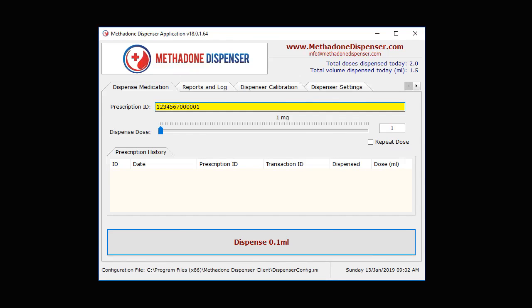All right. So see what happened this time. As soon as we enter the barcode, nothing happened. The whole system is just waiting for interaction before anything happens. At this point, it has captured the barcode and the quantity to dispense, and it does set the quantity to dispense at the correct value.